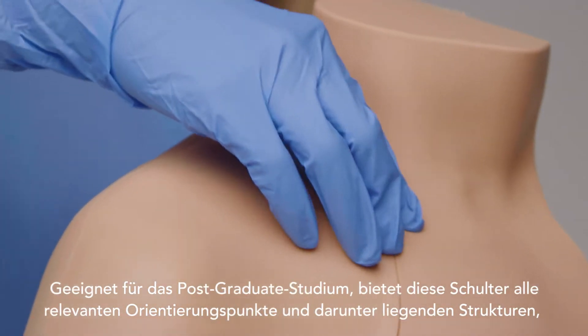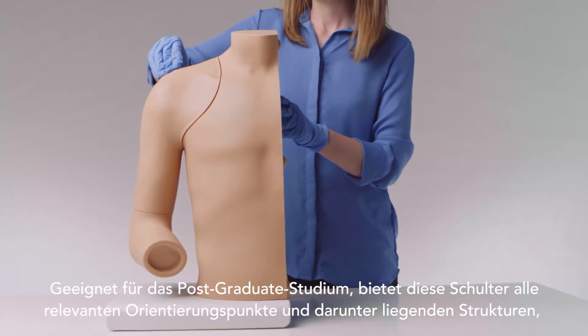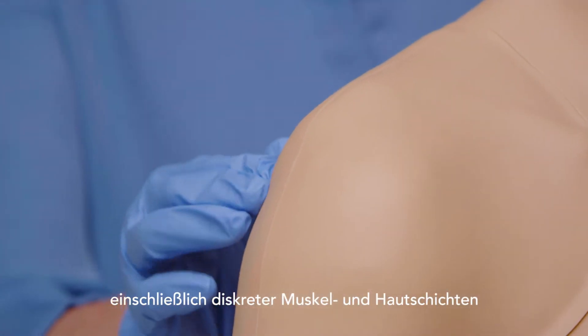Suitable for postgraduate learning, the shoulder features all the relevant landmarks and underlying structures, including discrete muscle and skin layers.